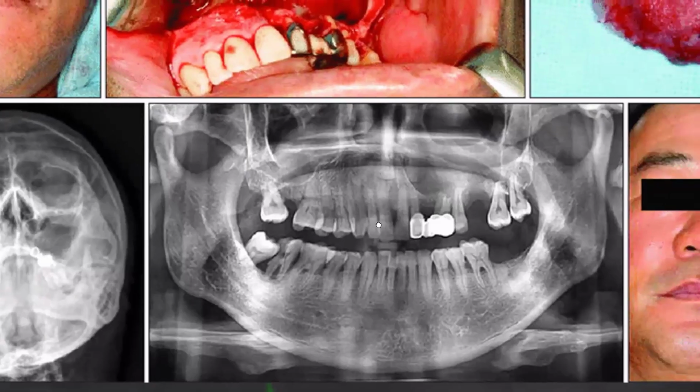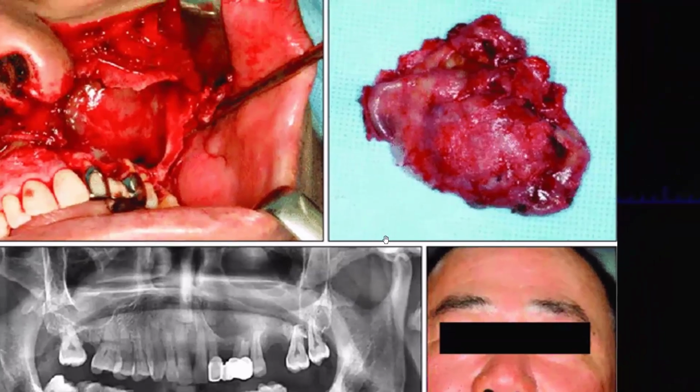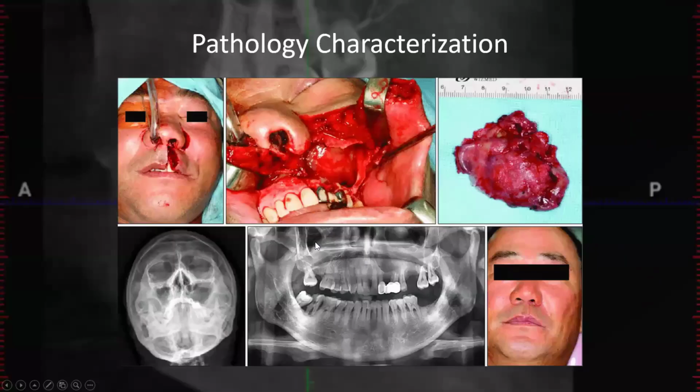Here we have an extracted tooth. Was it just something that came from that tooth? And this ended up being a tumor. I don't have in my notes what type of tumor this is. And so, a little subtle. I mean, if you look at these borders and say, yeah, that could just be a normal sinus border. Maybe there's an oral antral communication here where they have this molar extracted, and that could be part of the problem.